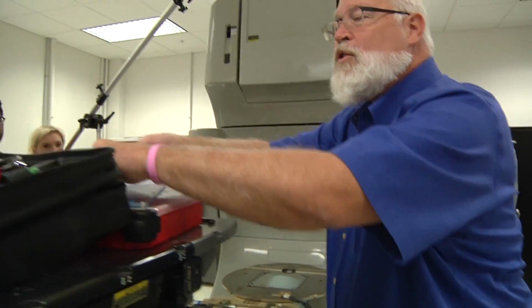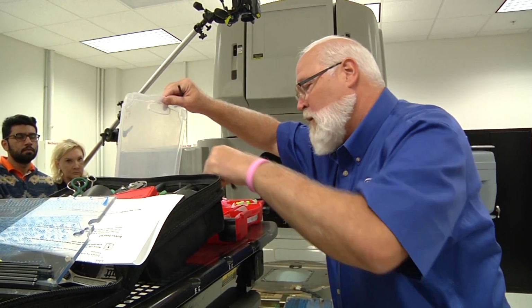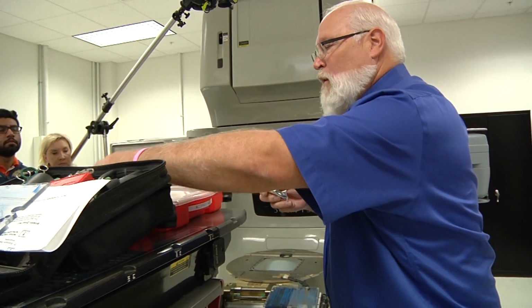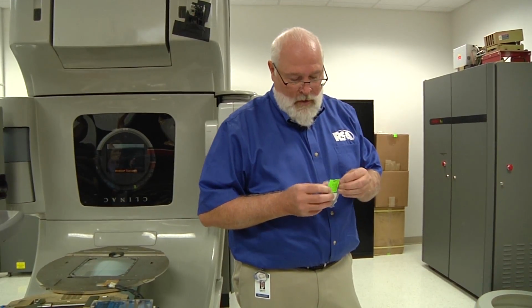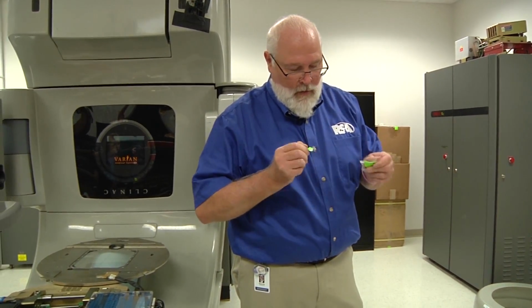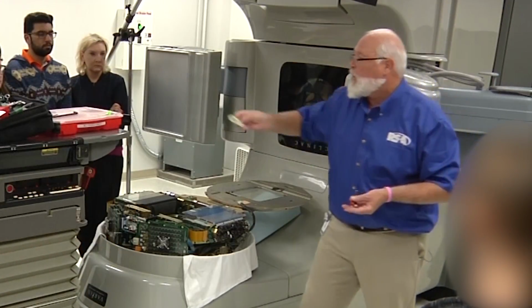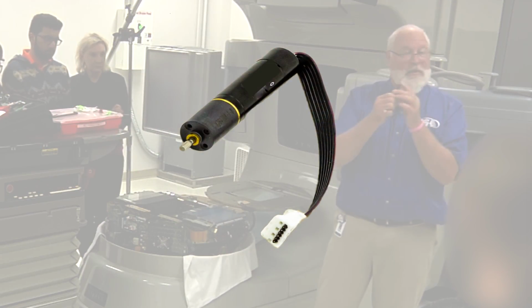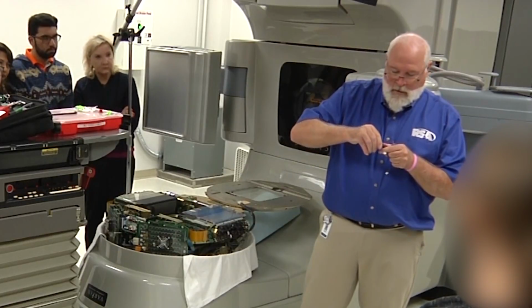So you guys have your spare motors. They'll be wherever you keep your spares. Some of you will put them in a drawer because you replace them a lot, or they'll be in another stand-up cabinet. Okay, so here's the new motor. You're going to have a protective cover; you take that off. Notice there's no coupler, so you have to take the coupler off the other motor. And it just pulls off.